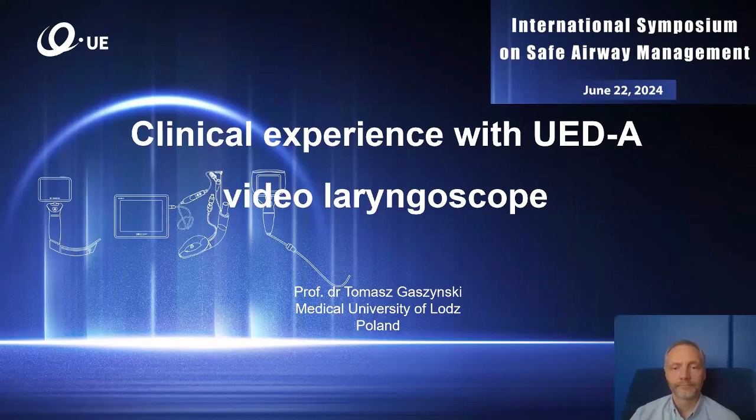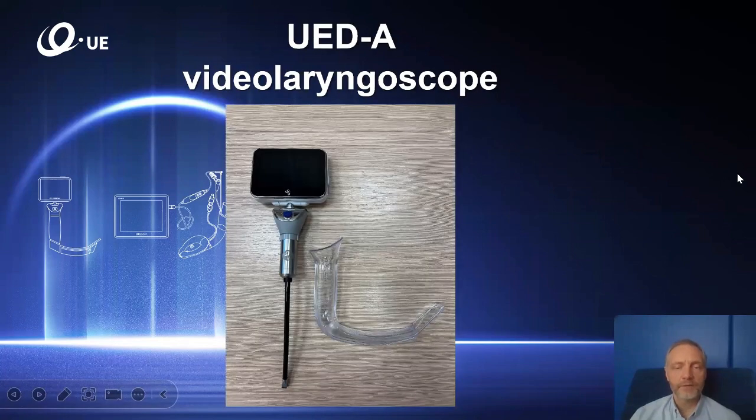On this slide, you can see the device. It consists of a display monitor with a handle that is in fact a camera, and a single-use blade combined with the cover for the handle. This is quite interesting, but also a popular possibility of using video laryngoscopes.